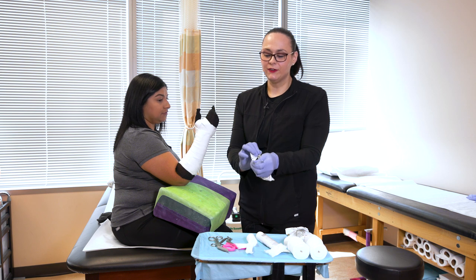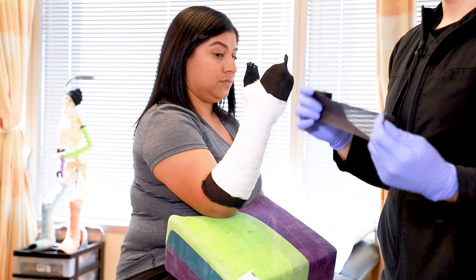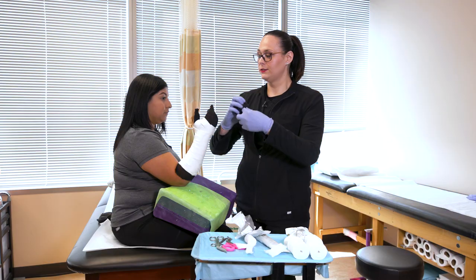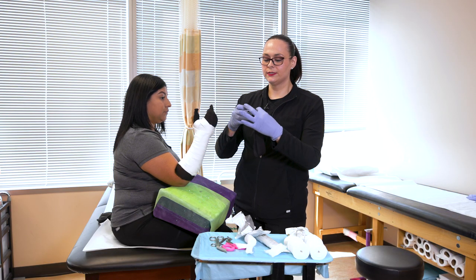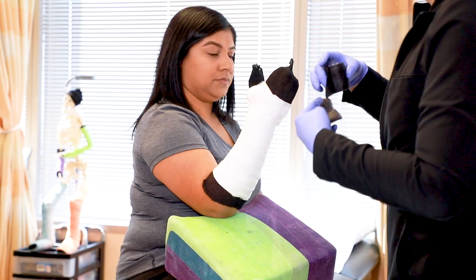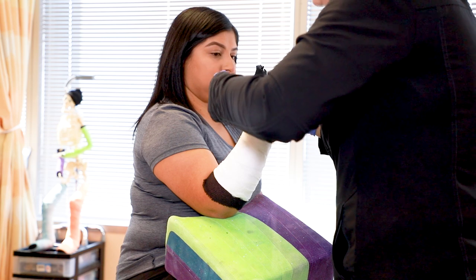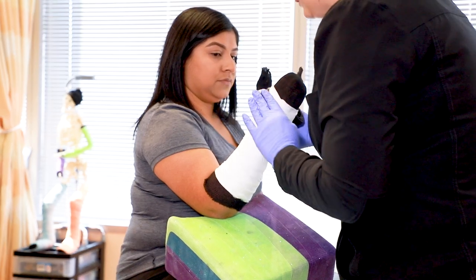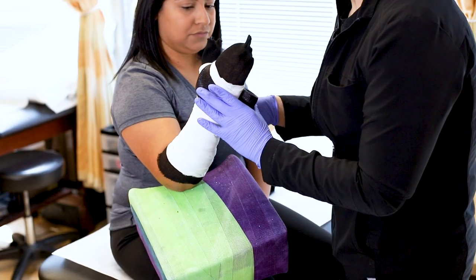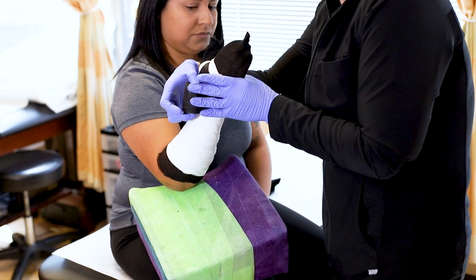Now I'm going to apply the fiberglass portion of the cast. This material does heat up a little bit — that's a normal sensation you will feel, it's only temporary as the cast cures and hardens. You always want to try your very best to hold completely still throughout the process so that you avoid creating indentions in the cast, which can become bothersome.